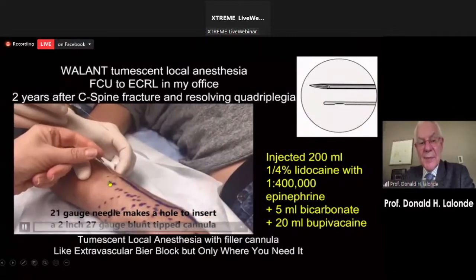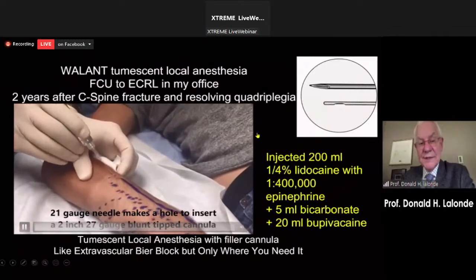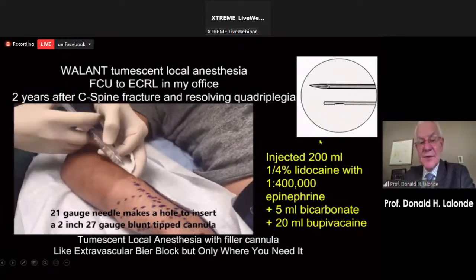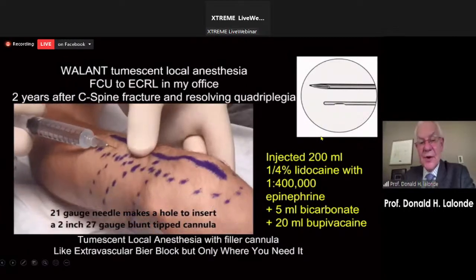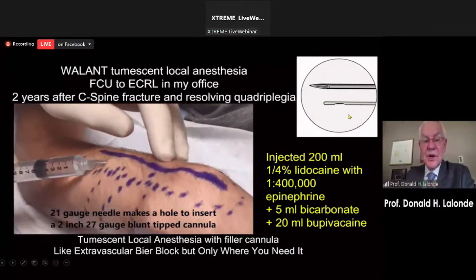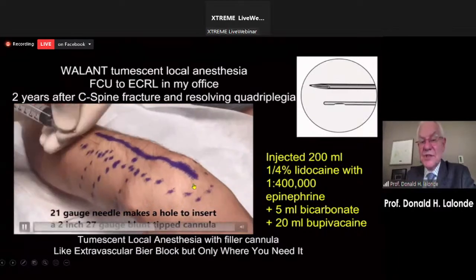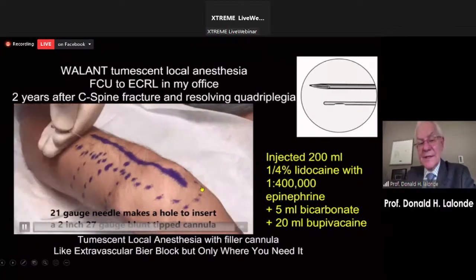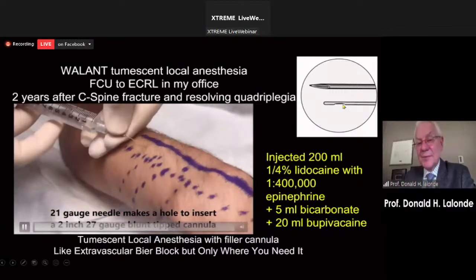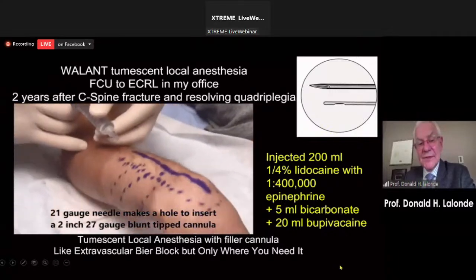So I made a hole with a bigger needle. Now I'm putting in this blunt-tipped cannula underneath the skin. This slides through the fat and doesn't hurt at all. So when you're using a cannula, you can go where the nerves are live and you can inject a much bigger area much faster. So if I'm doing a skin graft, I will use a blunt-tipped cannula to inject the local anesthesia because I can inject it faster.